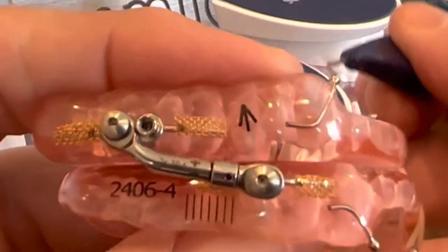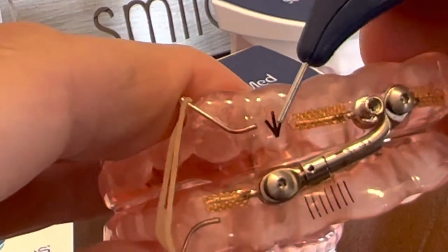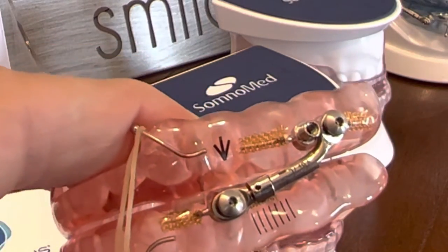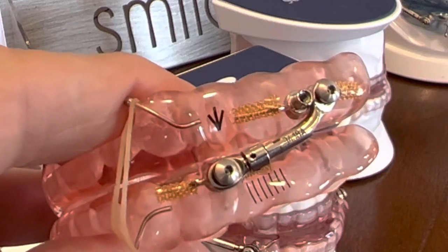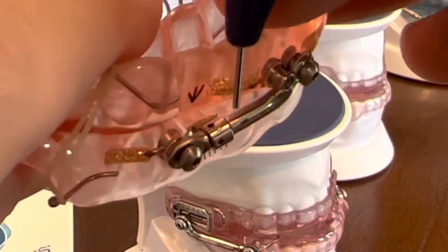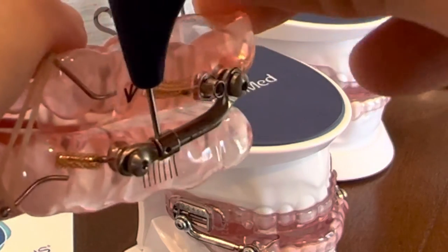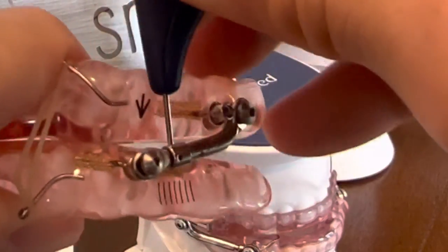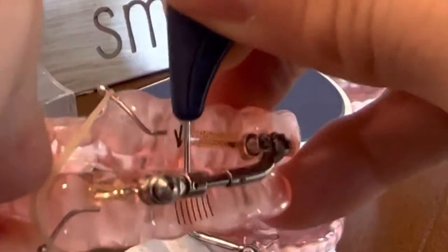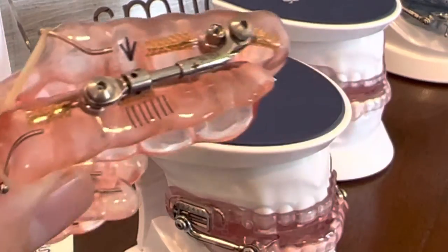Whatever I tell you to do on one side, you're going to do on the other side. Remember to follow the arrow because on this side the arrow is going in a different direction. Different devices have arrows going in the same directions, some have going in different directions. So if you go on this side, you're going to find the hole right there and you're going to engage it. If you have to kind of wiggle it in there to get in there, you're going to turn it towards the direction of the arrow and take it out.